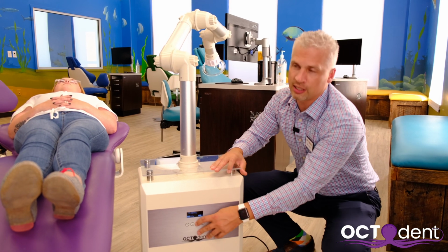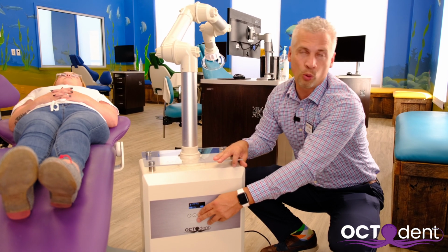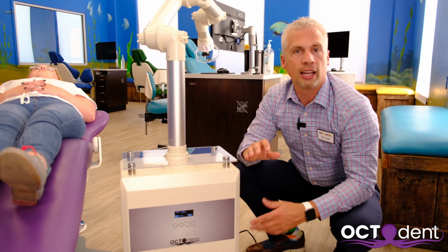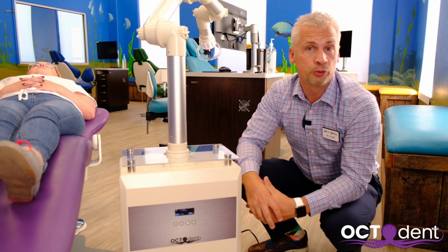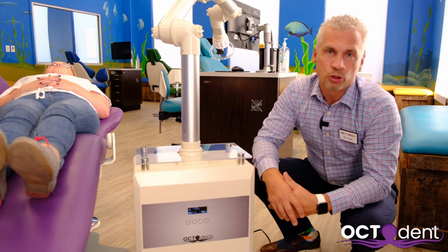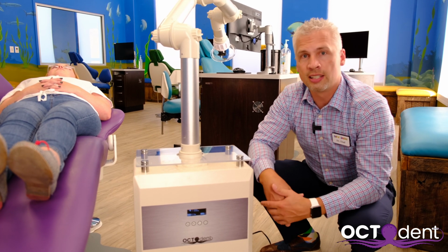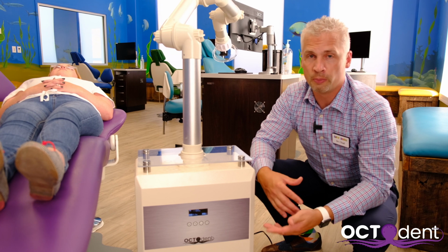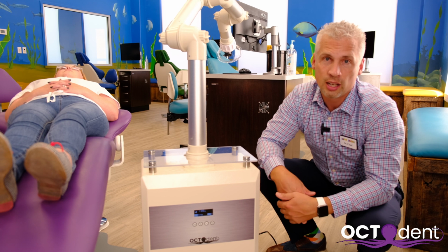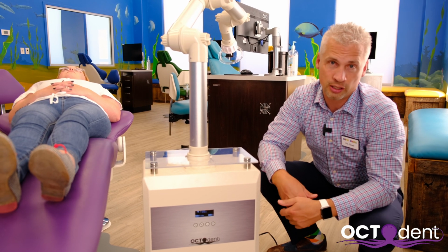Now, you might ask, why do we have any levels that are below 4? Well, you can still use 3. You can actually use 1. Right now it's on 1, and you can't even hear it. At this point, it's become an air purifier in your operatory. So if you decide to leave this on a permanent basis and continuously filter the air in your operatory, you can use levels 1 through 3 and do that very efficiently and effectively.